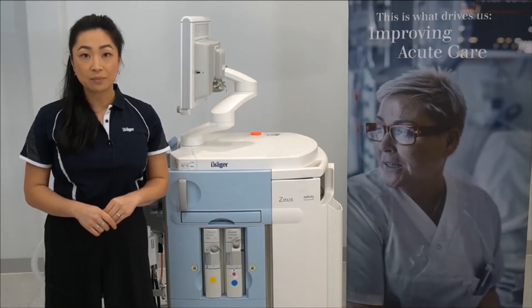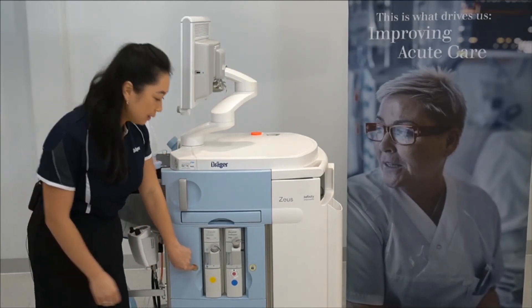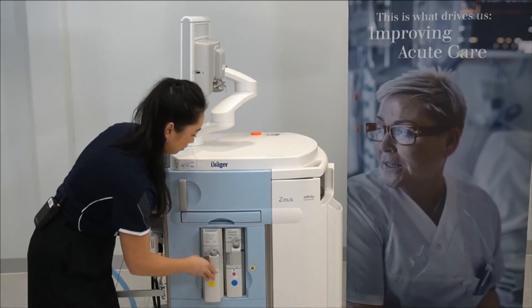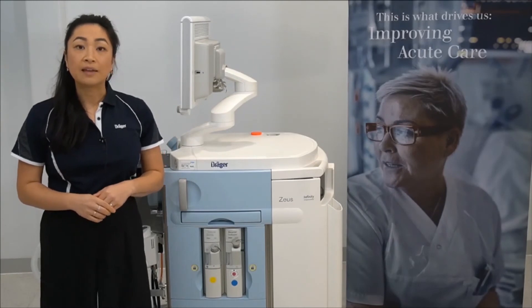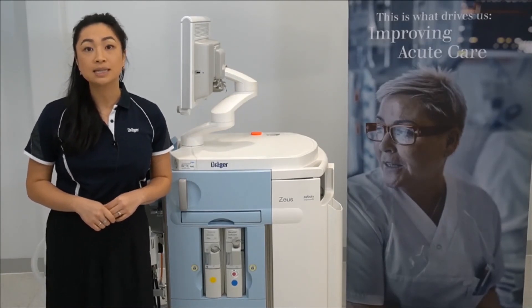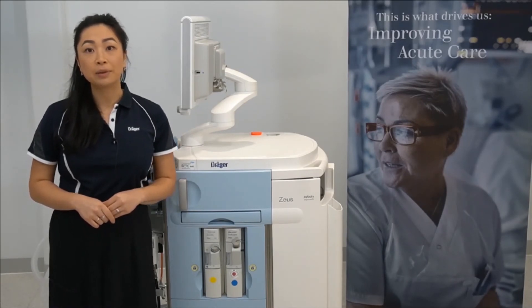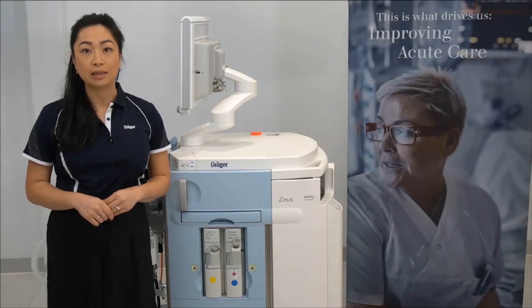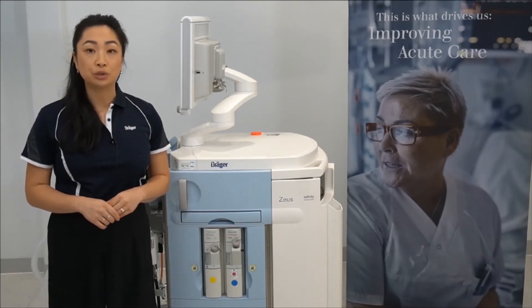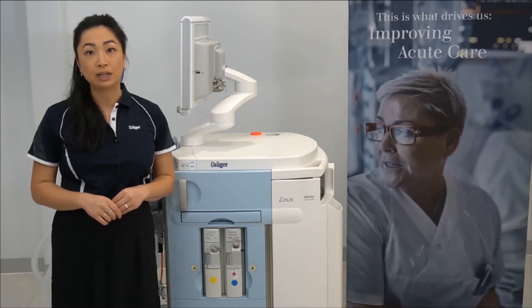To remove the DIVA metering modules, hold down the unlock button and slide the module out. If the unlock button is pressed during operation, this may cause an immediate shutdown of the metering modules and lead to a rapid drop in anesthetic agent in the breathing circuit. Filling of the DIVAs can be done with the modules either in or out, and is possible during operation.